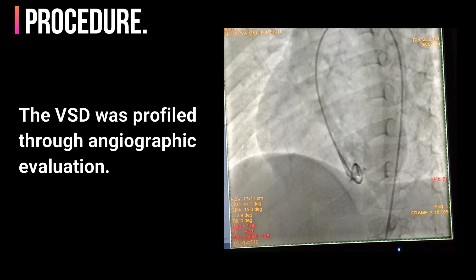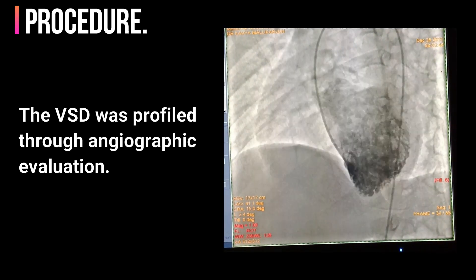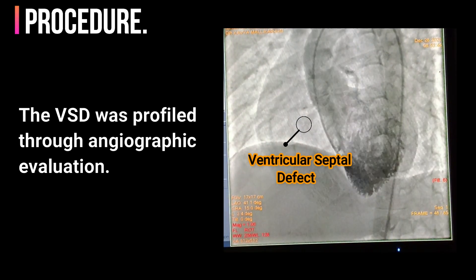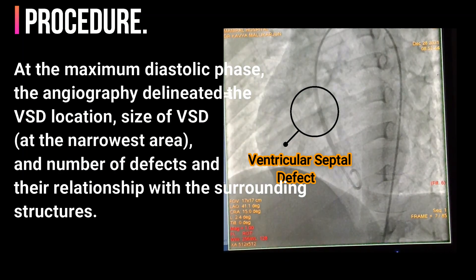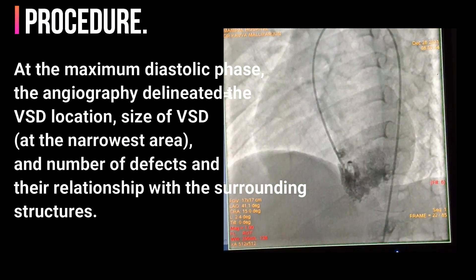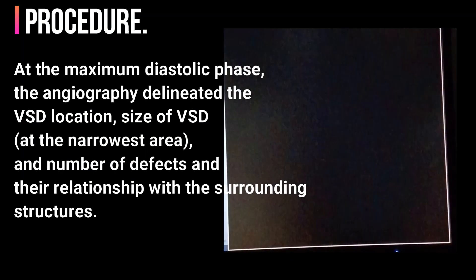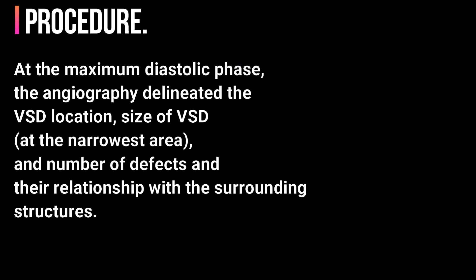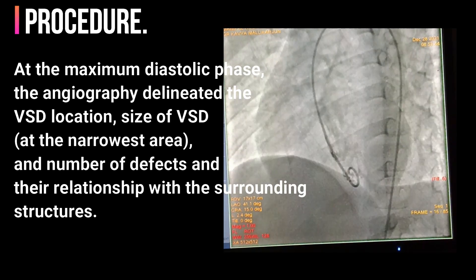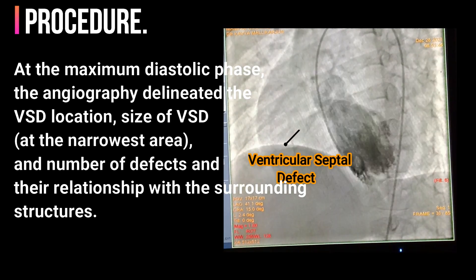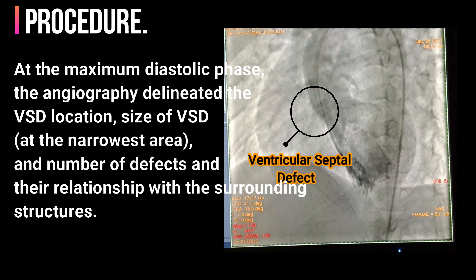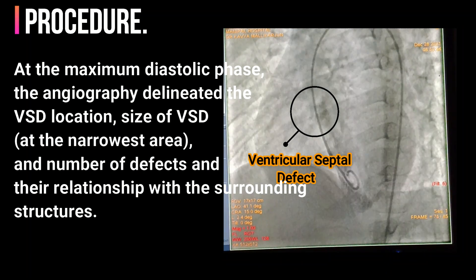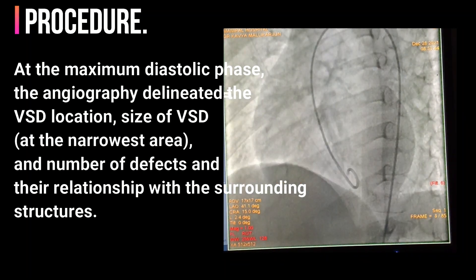The VSD was profiled through angiographic evaluation. At the maximum diastolic phase, the angiography delineated the VSD location, size of VSD at the narrowest area, and number of defects and their relationship with the surrounding structures.